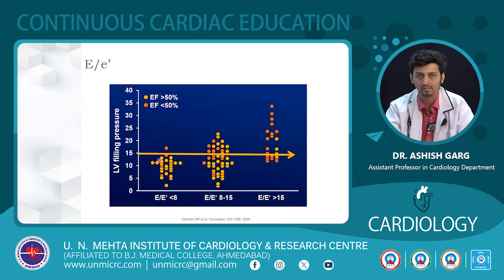So again, this slide is reflecting the same, that when the E by E dash is more than 15, the LV filling pressure is elevated, more than 15.